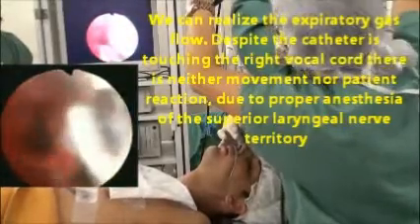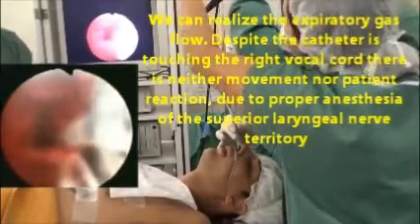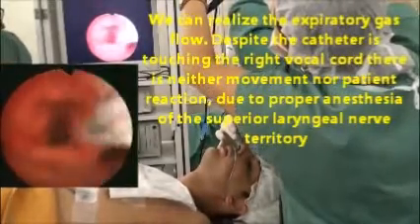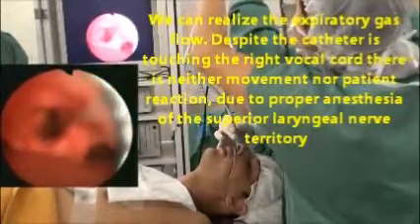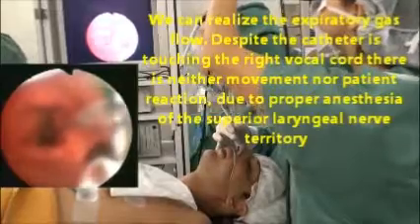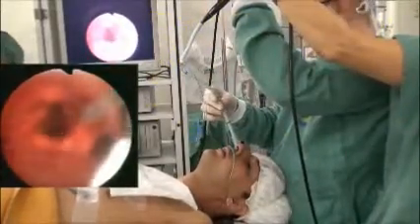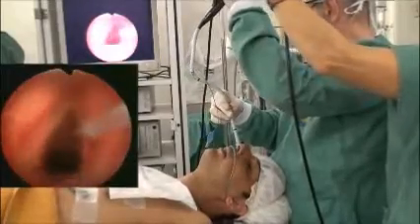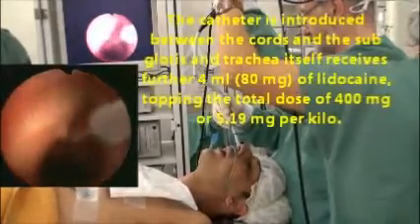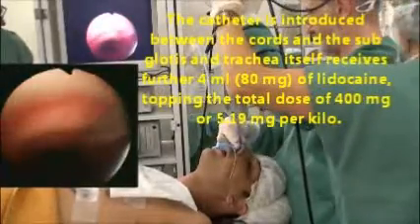Superior laryngeal nerve territory is properly anesthetized, and we can see that by the lack of reaction of the vocal cords in contact with the catheter. We can see the movement of the vocal cords according to the respiratory phase, and we can appreciate the expiratory gas flow of the spontaneous ventilation, but there is almost no reaction of the patient.